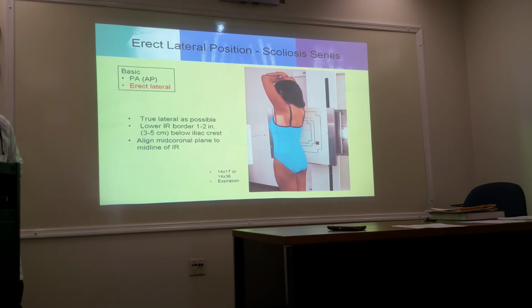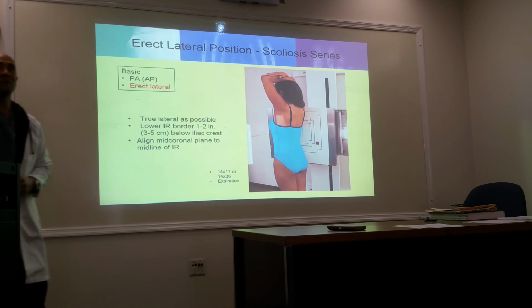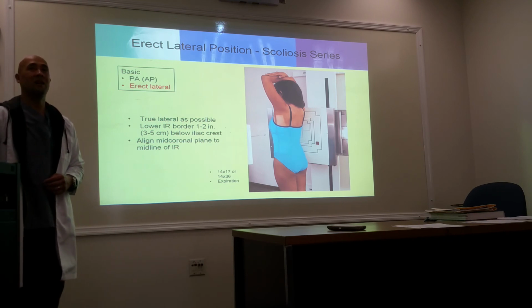They have long receptors. I had a chest X-ray over the weekend, and it was digital, and she had to take 2 because she clipped one side, and even on the one where she had me perfectly centered, they clipped both.